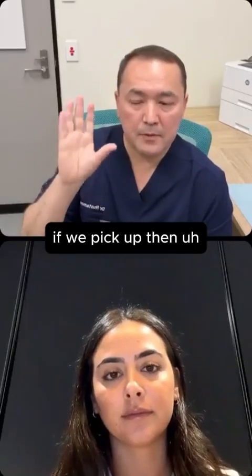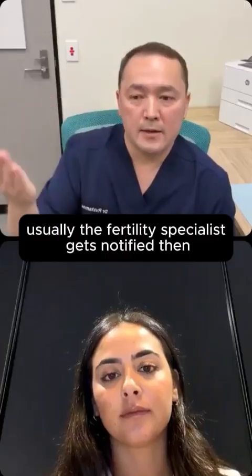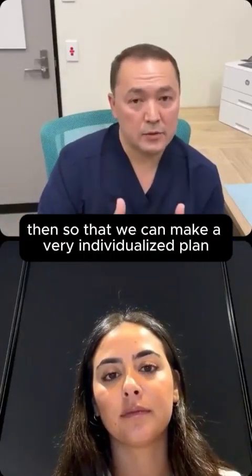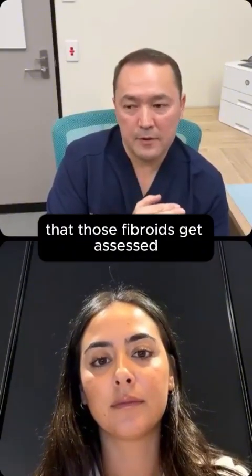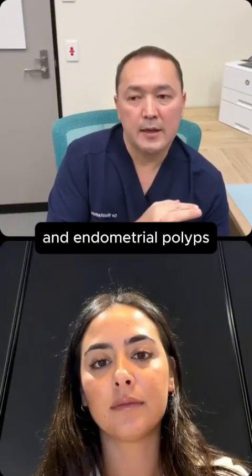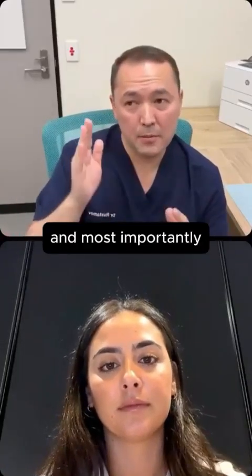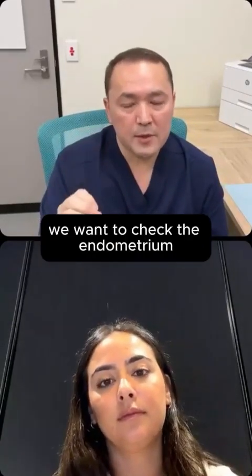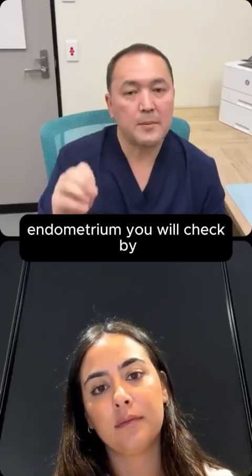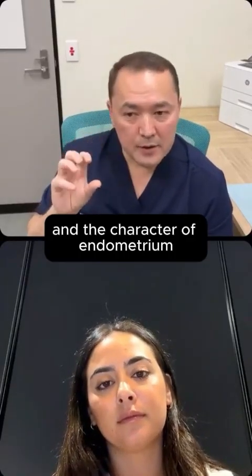If we pick it up, then usually the fertility specialist gets notified so that we can make a very individualized plan. Also, if there are any uterine fibroids, those fibroids get assessed, and if there is an endometrial polyp, that gets assessed. And most importantly, especially if you're planning to do a fresh embryo transfer, we want to check the endometrium. You check the endometrium by checking endometrial thickness and the character of the endometrium.